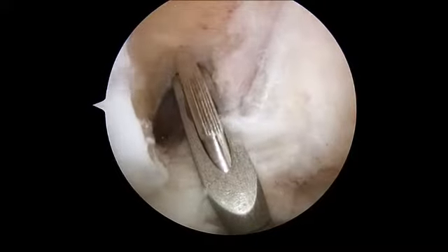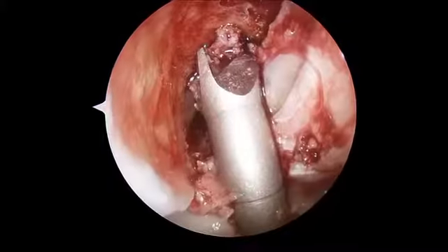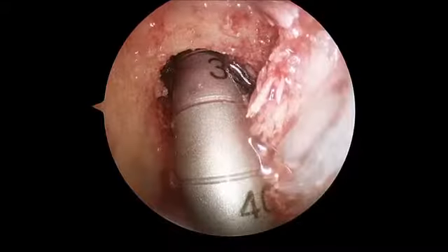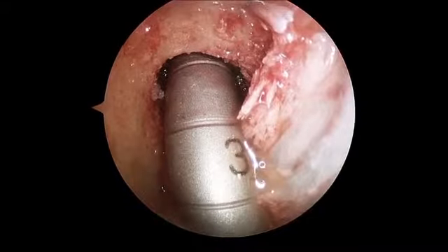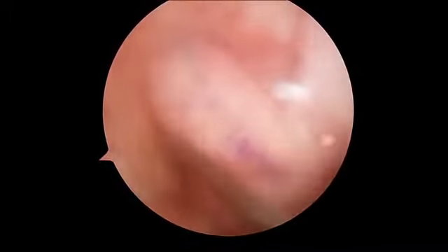Again, we have a guide bringing us 7 millimeters forward. This makes sure that I have 7 millimeters of space so that I don't have my ACL being rubbed by that notch. We have a 10 millimeter reamer creating our femoral tunnel. Now this pin has passed all the way through both tunnels, and it guides our graft, our new ACL, up.